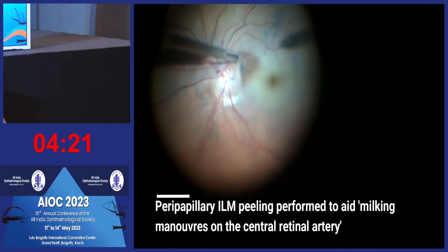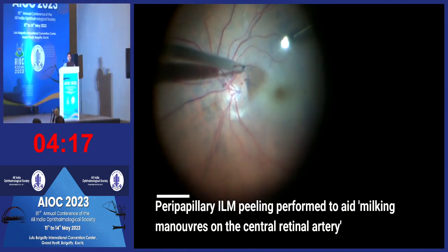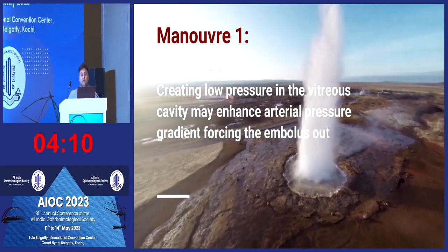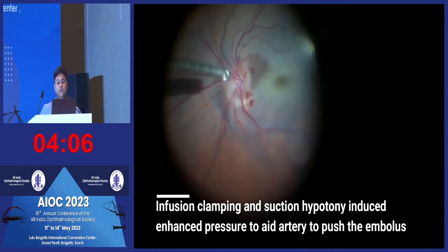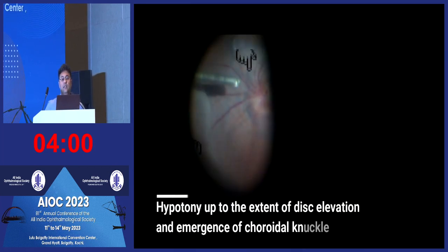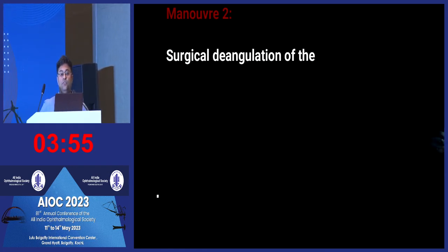After doing that, we also peel the peripapillary ILM, because we are going to do all our maneuvers on the artery over there in terms of dislodging the embolus. The first procedure is decompression. What we do is make the pressure negative inside the vitreous cavity. You see here the disc is lifting up and you also see a choroidal knuckle developing. We just keep the vacuum on and the infusion off, and once we do that, we hope that the arterial pressure will push the embolus out.